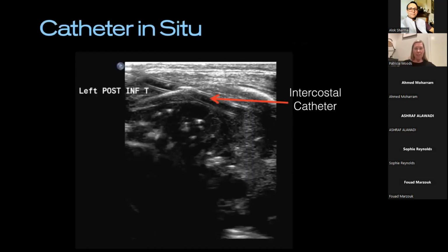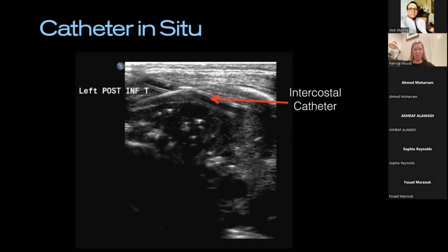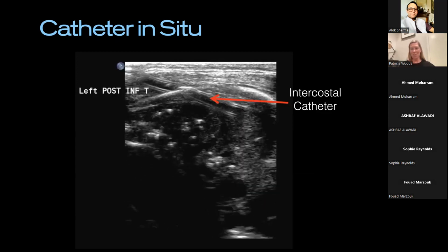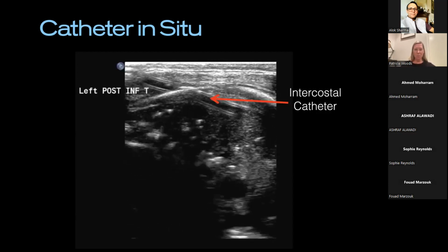You might be lucky, I think this isn't a pigtail, this is a decent catheter I managed to get here that's traversing the chest wall and through the intercostal space. Again, you're going to come up with problems all the time, aren't you, with chest drains? Are they kinked? Are they blocked? Are they dislodged? What's happened now? And again, just observing, I've got hepatized lung here.